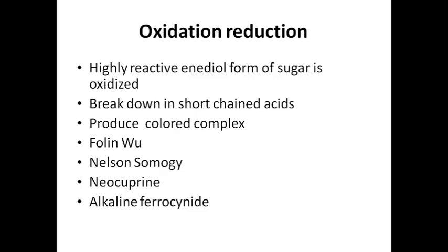Several methods are based on oxidation reduction reactions of sugar like the Folin-Wu method, Nelson-Somogyi method, Schaefer-Hartmann-Somogyi method, neocuproine color reaction, alkaline ferricyanide method, and so on.